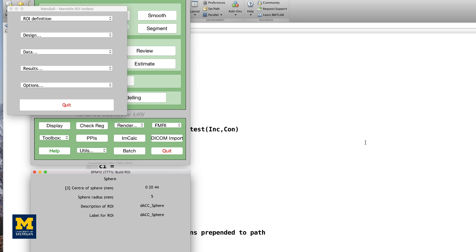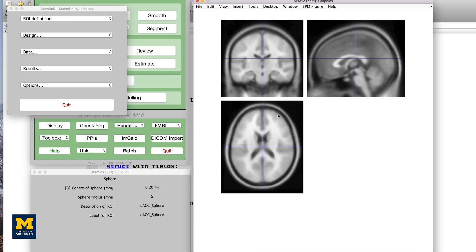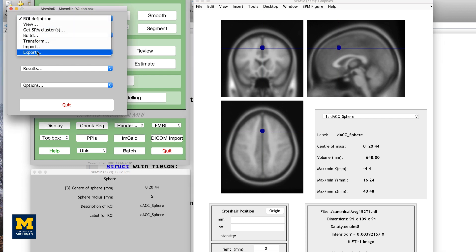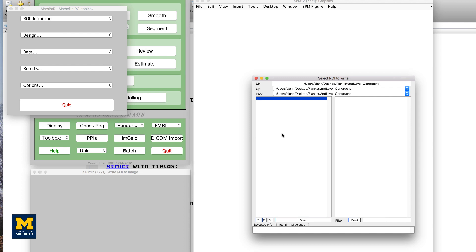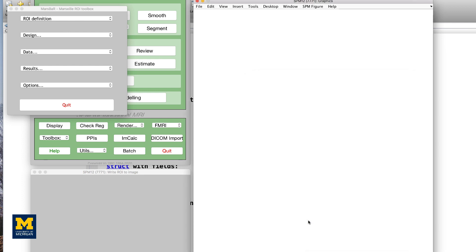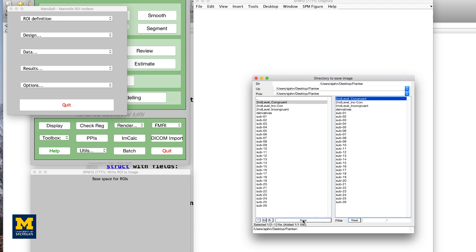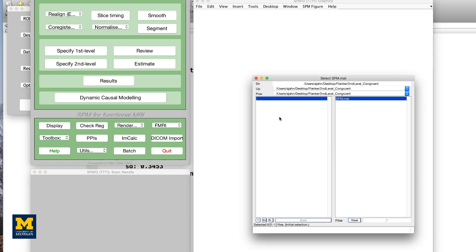Before we generate the ROI as a NIfTI file, click on ROI Definition and select View. Click on your newly created .mat file and make sure that the ROI is located in the region where it should be. If the sphere is in the right place, go back to Mars Bar ROI and select ROI Definition, then Export. In the Export ROIs drop-down menu, select Image, and from the Selection menu click on the DACC_Sphere_ROI.mat file. Leave the space for ROI image as default and select the Flanker directory as the output folder. Label the image as DACC_Sphere. We now have a mask that we can use for our ROI analysis, using the same method as we did previously for extracting data from the anatomical mask.